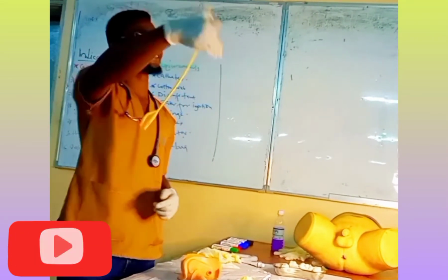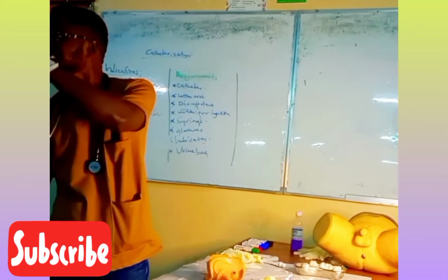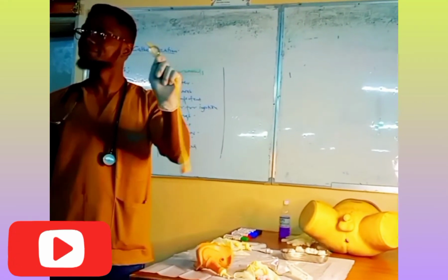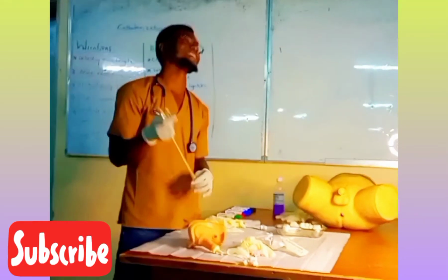I was saying this. You balloon when it is inside the urethra, when you have not yet reached the bladder, what is going to happen? It will burst. So the urethra is going to burst. What next? What next when you burst someone's urethra?